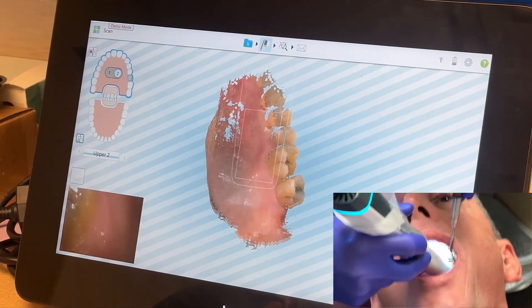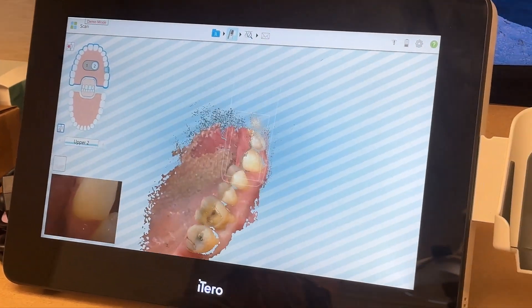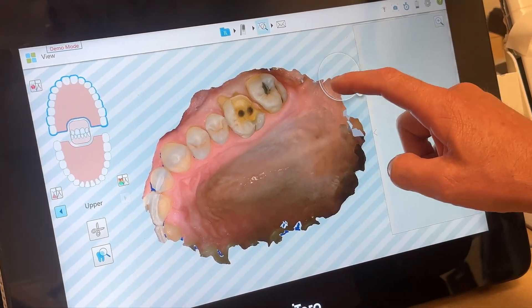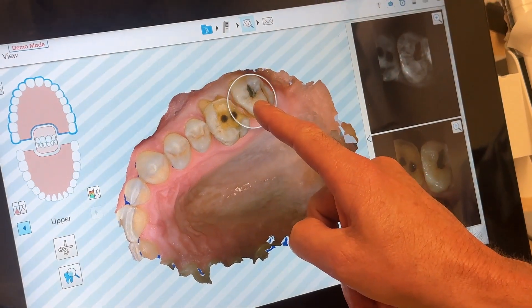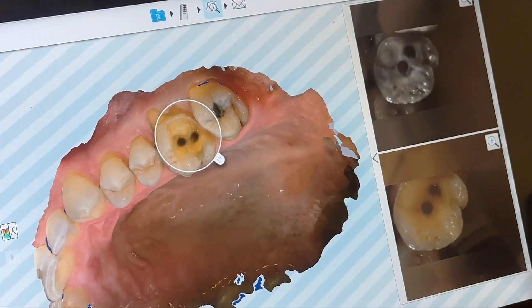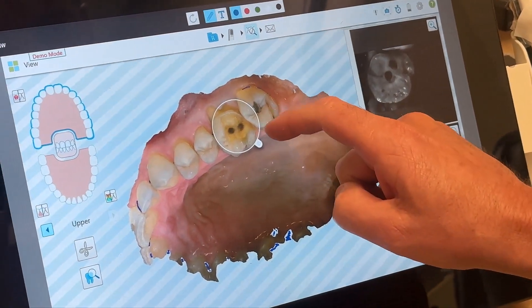We could have cut the pre-prep tooth out in the software and simply scanned the post-prep tooth — we just didn't do that in this video, but you can definitely do that. A really nice feature is the ability to capture clinical photos right from the Lumina scan. In the upper right you can see NERI, a software feature for interproximal caries, and in the lower right are actual clinical photos. You can take a scan of the entire mouth and walk the patient through all their clinical photos — and you can also use those internal photos for insurance purposes. No need to grab a camera; you can grab the photos right from the scan. You can also take screenshots and draw on them with arrows, circles, writing — whatever you want. Everything's stored in the patient record.